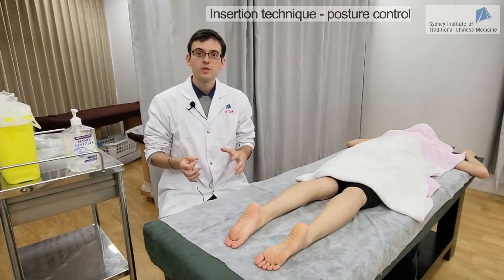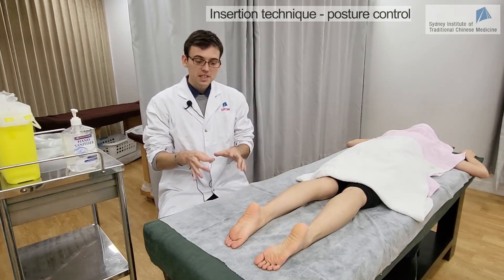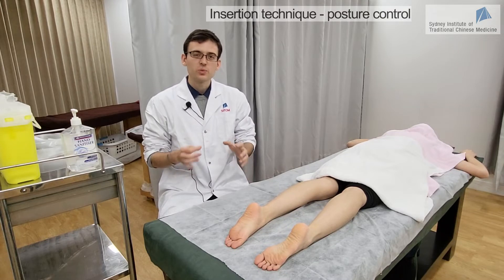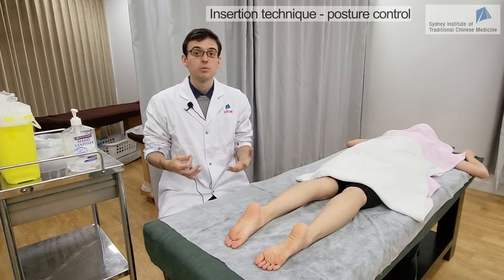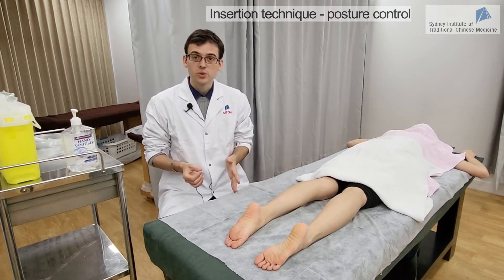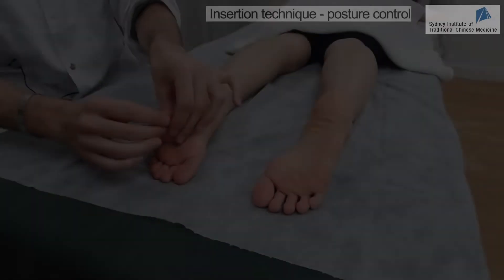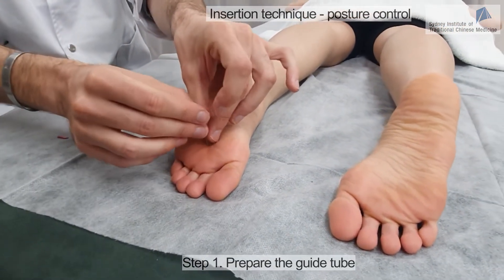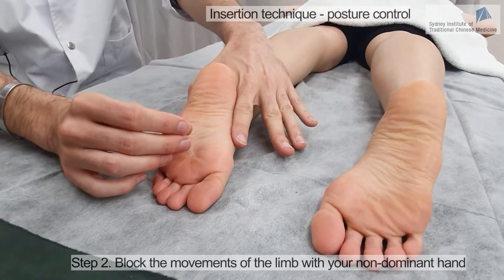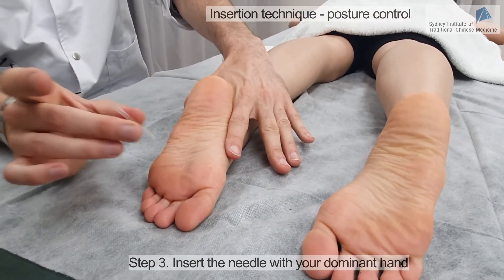For some points, you may need to have posture control. With Kidney 1, this point can induce a reflex reaction, and this reflex reaction can disturb the needling process. Because we don't want that to happen, we'll have to control the position of the patient. We have the needle in place and we're ready to insert it. I'm using my second hand to control the posture of the patient, and then I insert it this way.